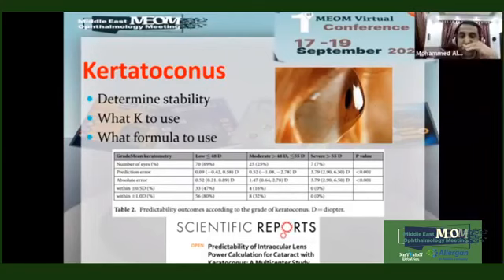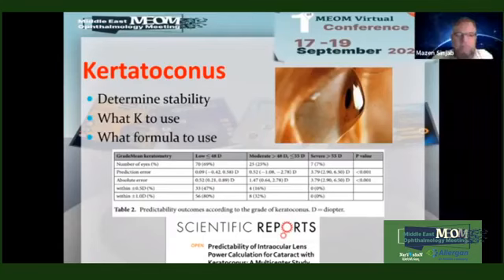Dr. Mazen, in case of keratoconus, how do you decide about the K readings? Okay, great. Now I agree with Dr. Sandeep. There are several factors affecting the decision. Stable or unstable, of course, age of the patient. The cornea is clear or there is an opacification, a scar because of keratoconus. And the third factor, whether it is keratoconus or pellucid marginal degeneration. I differentiate between both by topography, of course.